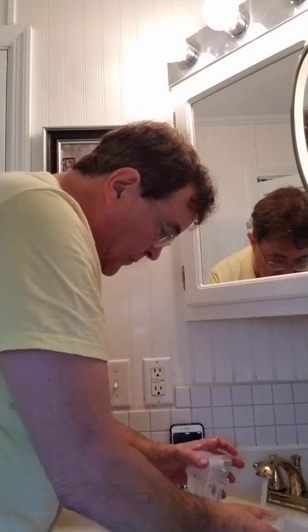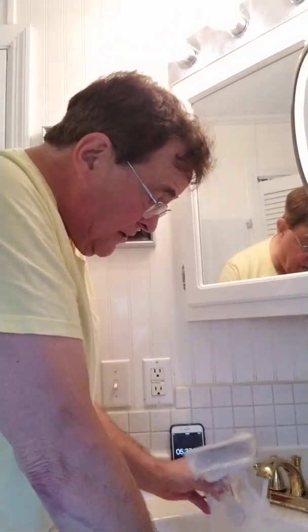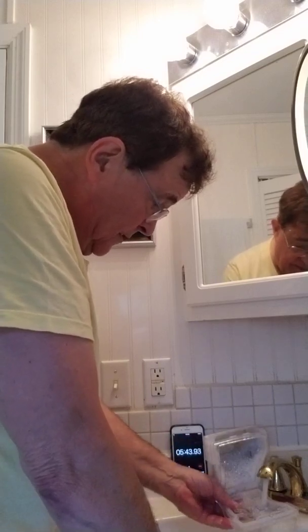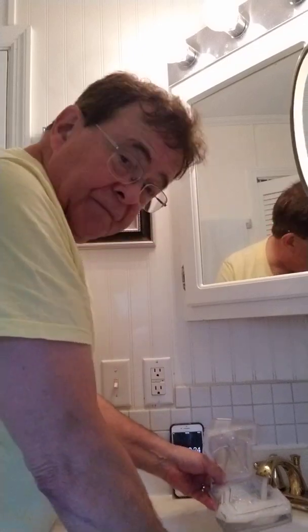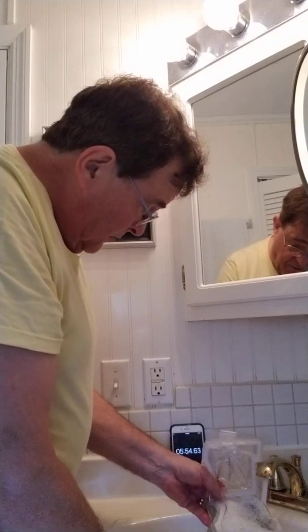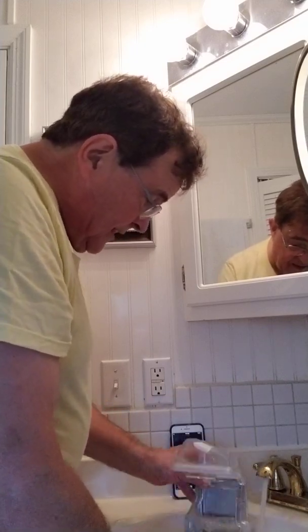Ooh-wee. Now, it's important for us to get all that soap out. But the other thing that's coming out is any bacteria that's sat there growing all night. And by golly, the top's done. Yeah, sometimes that soap is kind of fun to get out, but as you see there, oh gosh, guess what? Just at 6 minutes.